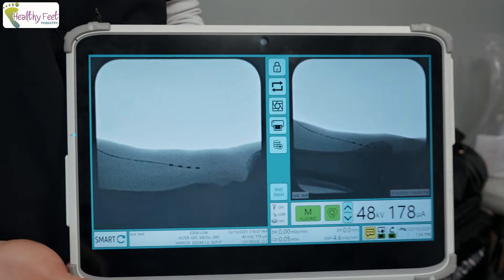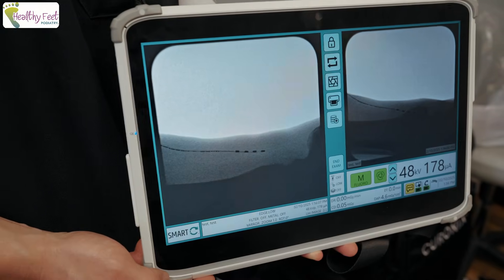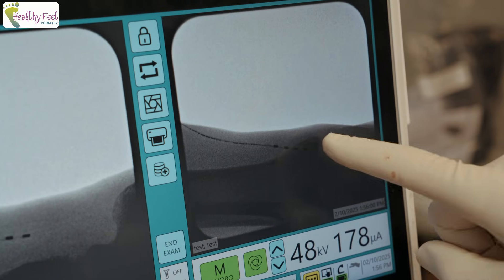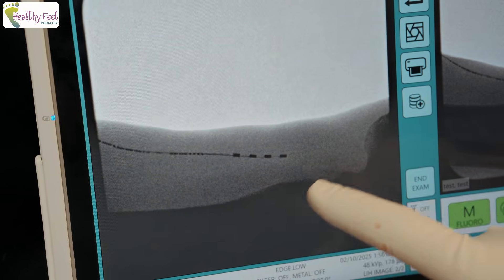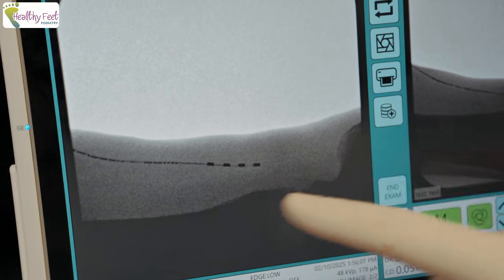On this view, you want the lead to be behind the medial malleolus or the tibia right here. You don't want it past the ankle joint because you run the risk of causing an issue. You can see the back of the tibia here — you want it behind there because that's pretty much right where the nerve runs.